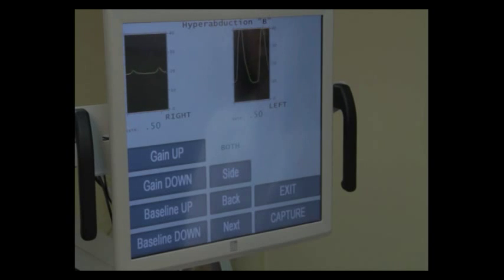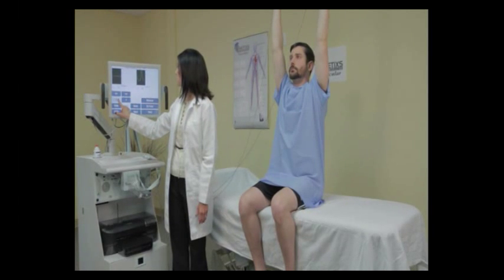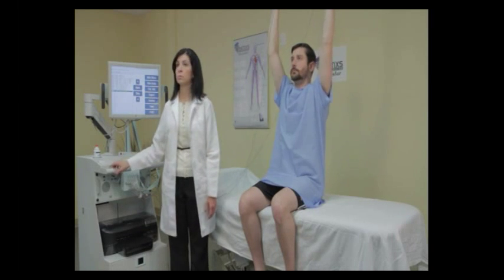There are a number of other positions that can be employed. These are several of the most common maneuvers. If you have maneuvers that you like that are different than these, contact your NETX representative and they can program this to have your positions in this study.